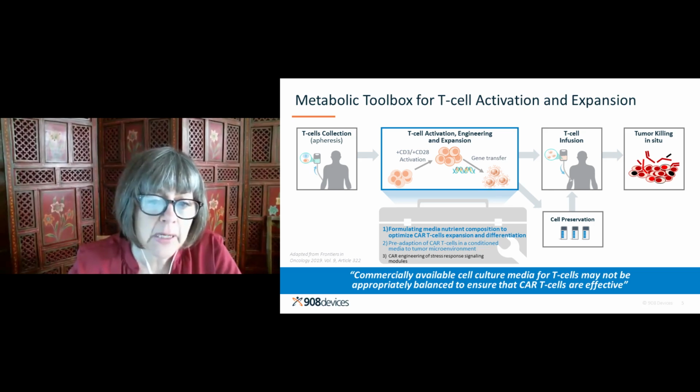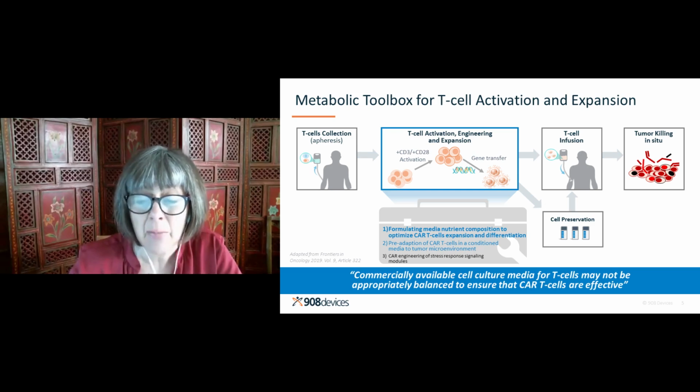We learned that formulating cell culture media and specifically key nutrient composition is very important for their activation, expansion, and differentiation. An interesting quote from this review reads that actually commercially available cell culture medium that is designed for T cells may actually be not appropriately balanced to ensure CAR T cells are effective in vivo. So there's work to do to optimize these media, and we'll see some data about that.